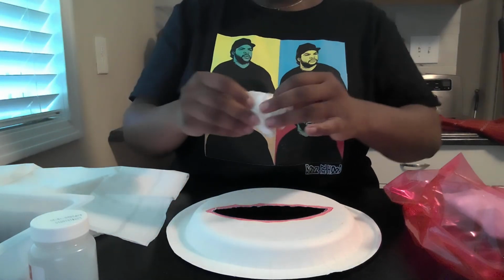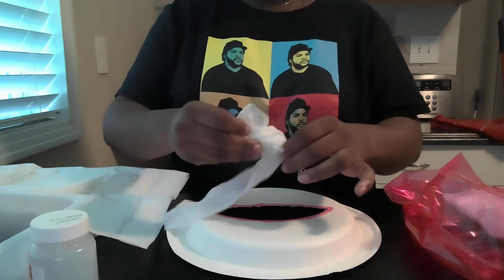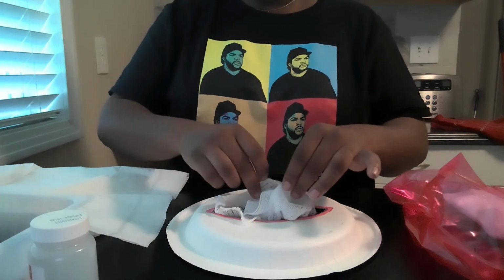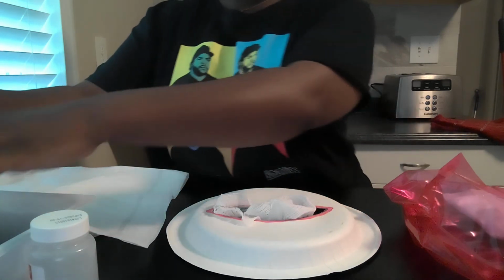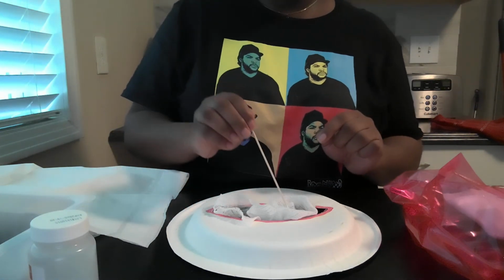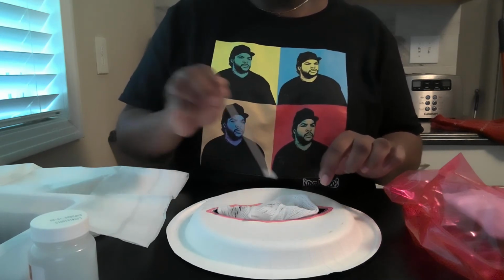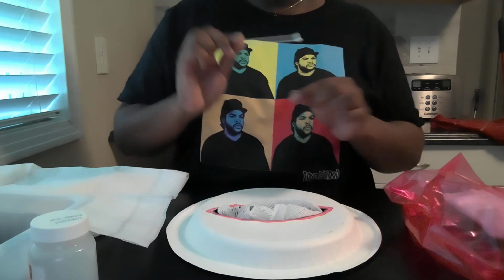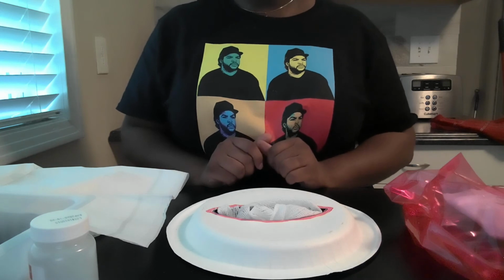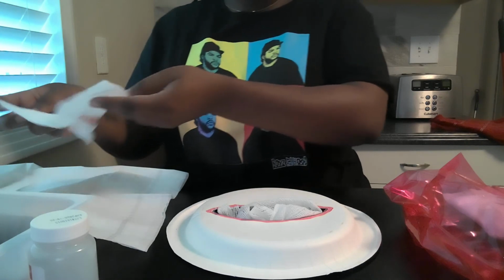And you're going to pack that into the wound. For the purpose of this video, I'm going to pack it in with my gloves. You can also pack it in with the sterile cotton tip applicator. You can just push that in as well. Either or. And then once you've done that, you can throw that away. Now it's time to put some new gauze on the wound on top of that.